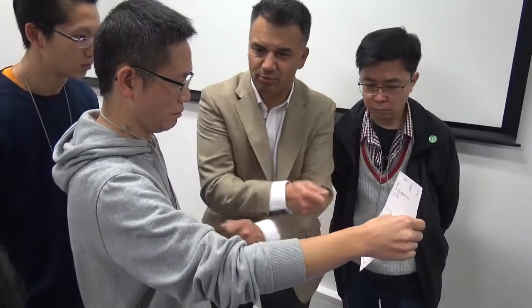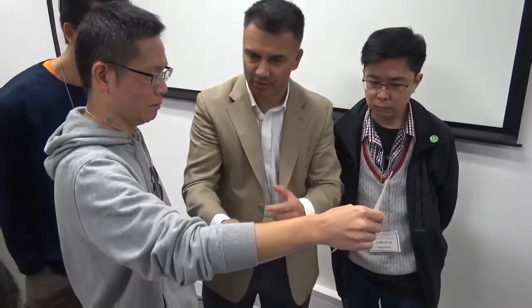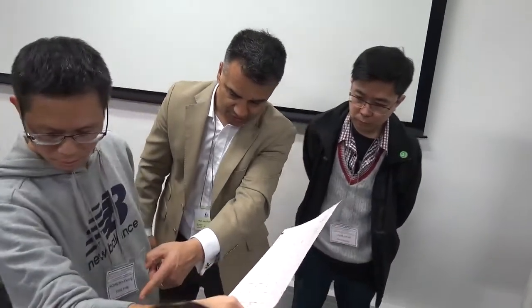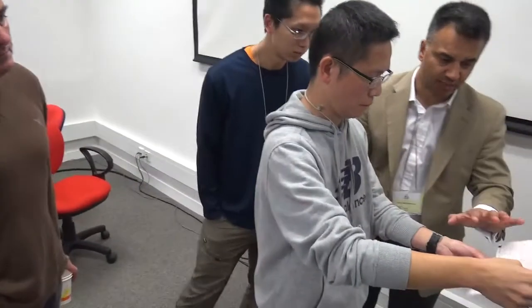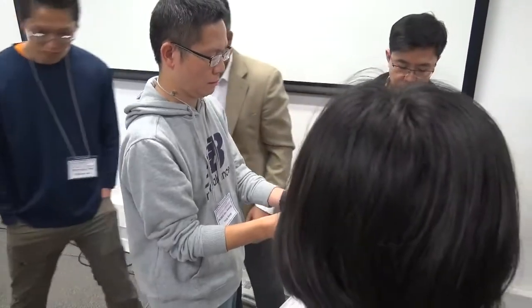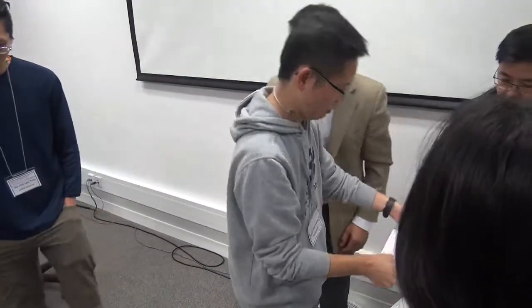Not often, but every now and then you get the limb leads in your haste, you put them on the wrong limbs, don't you? Yeah. Your right is on your left and what have you. So if that's inverted in aVR, I'm pretty confident that the limb leads are in the correct position. I look at the chest, I see that the chest leads are in the correct position. I'm happy to say, right, we can finish with that and we can interpret that later. Okay? Very good. Well done.